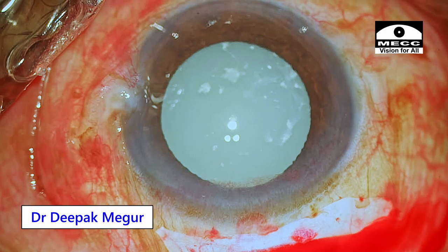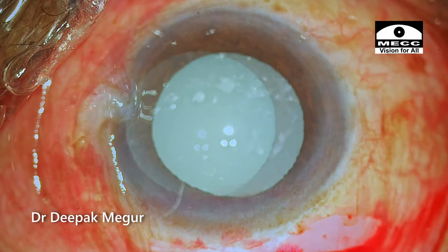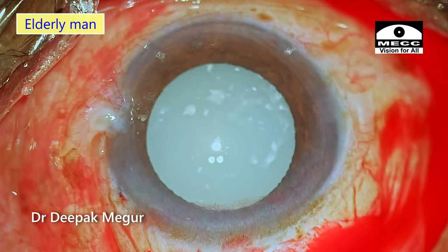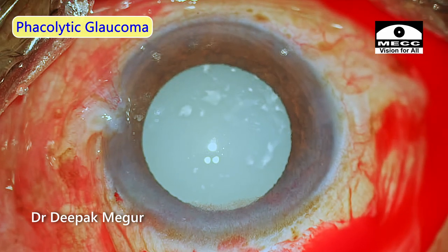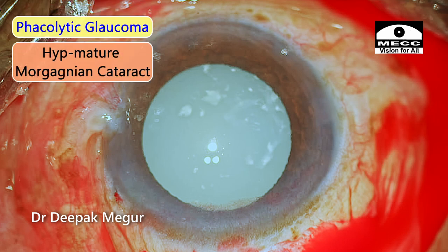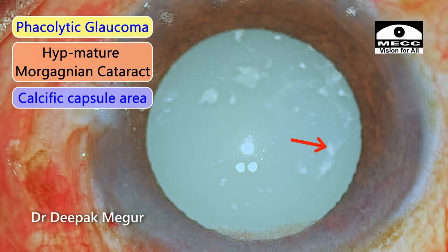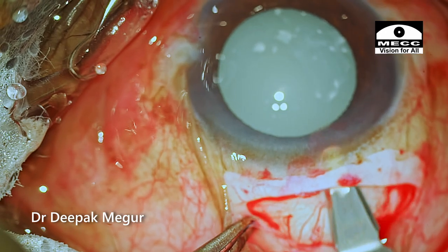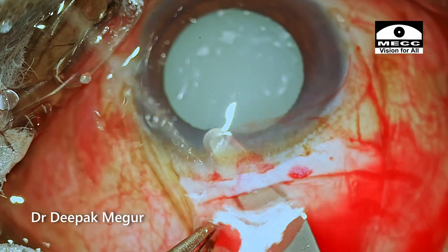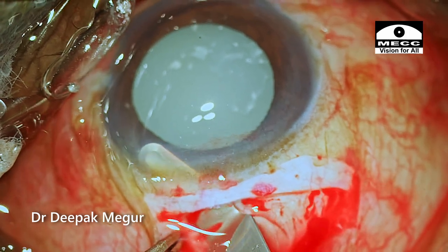Hi, this is Dr. Deepak Meghur. Let's have a look at one of my old cases and try to learn something here. This is an elderly male patient who is having phacolytic glaucoma with a hypermature morgagnian cataract. You can see these calcific spots on the anterior capsule, all suggestive of a very long-standing cataract, and we expect a very weak capsular bag as well as zonules in this patient.